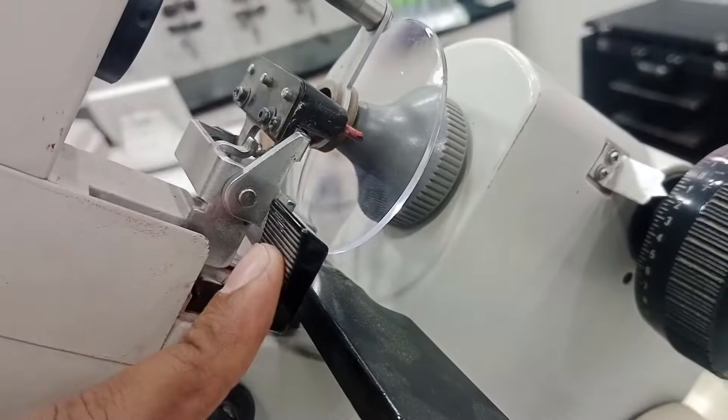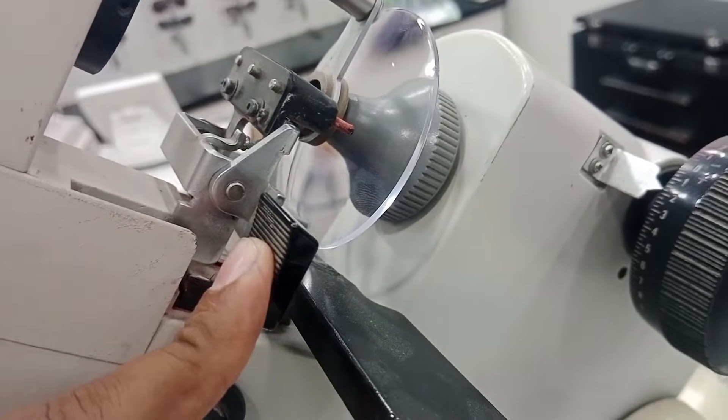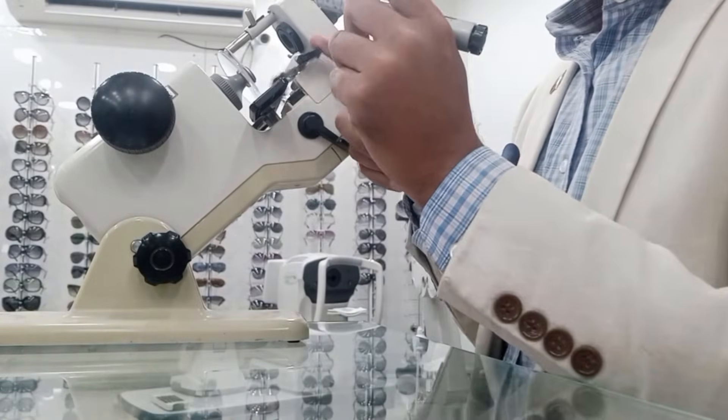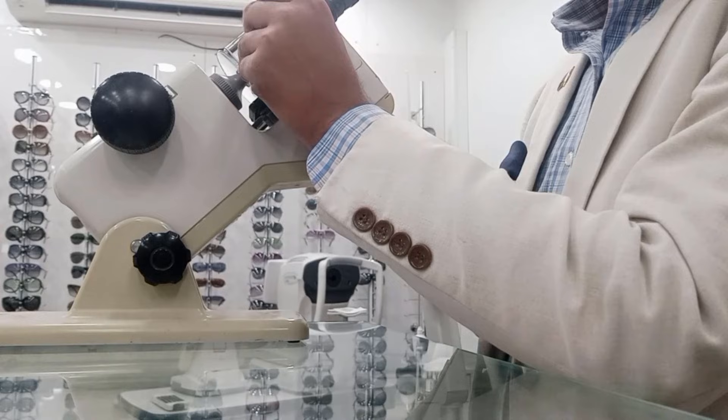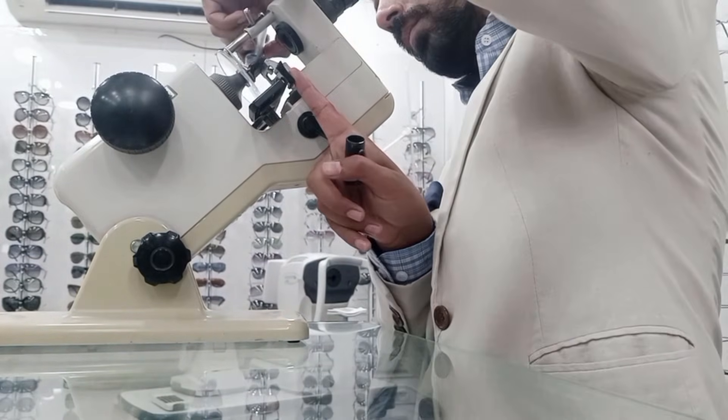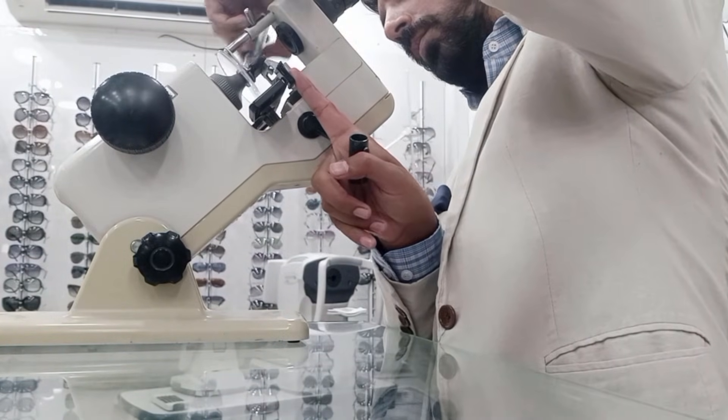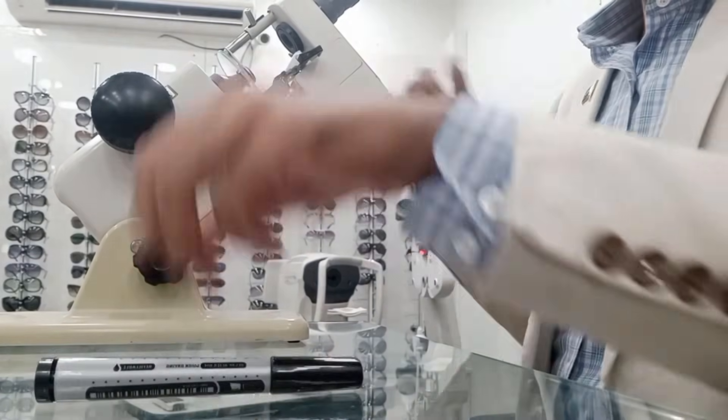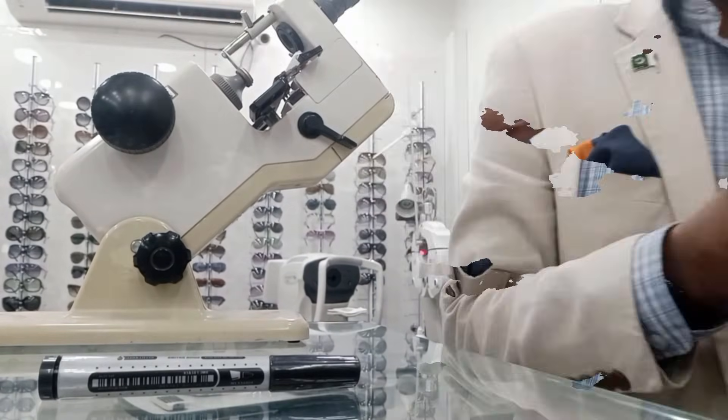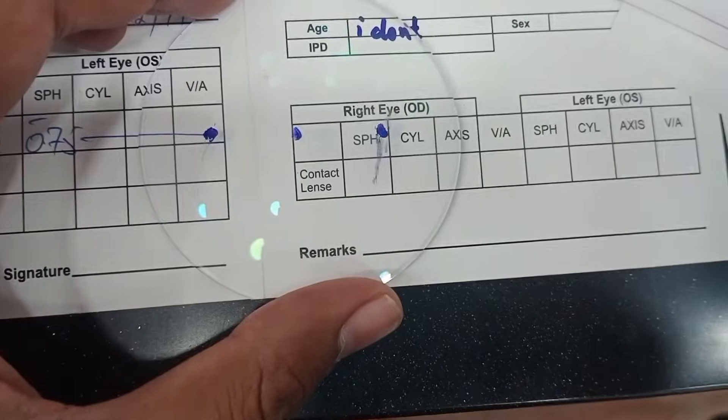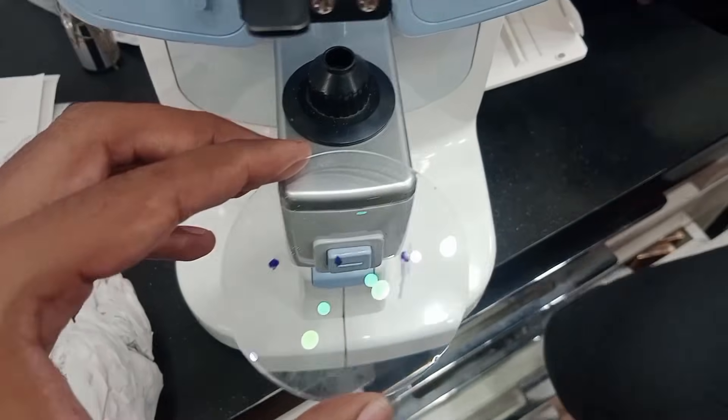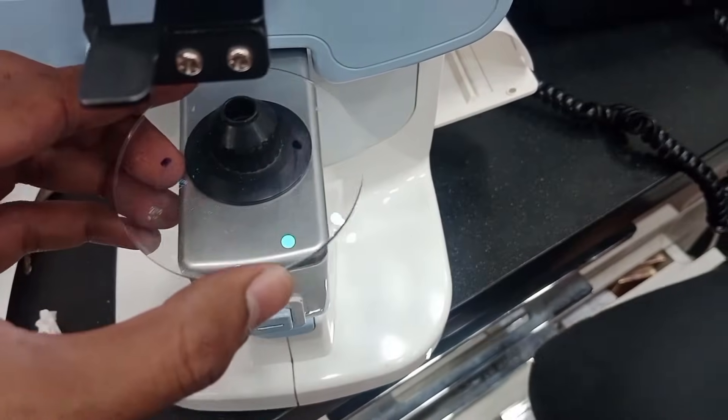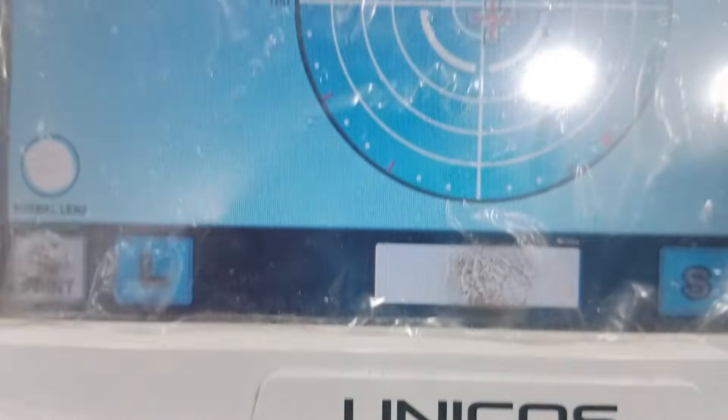But unfortunately, the markers are not working, so I have to put the axis manually with my permanent marker. The middle dot is the optical center, and this we can check on a digital lensometer.